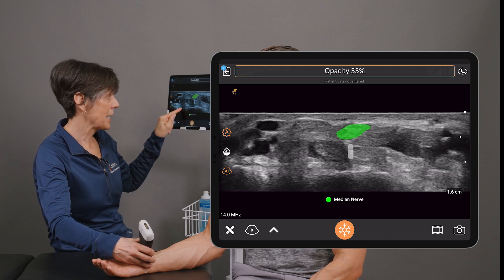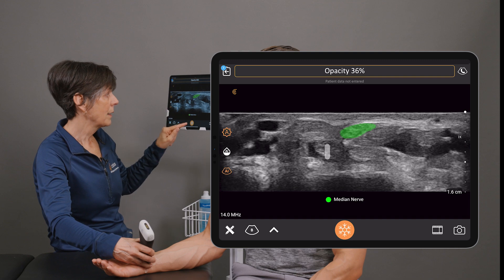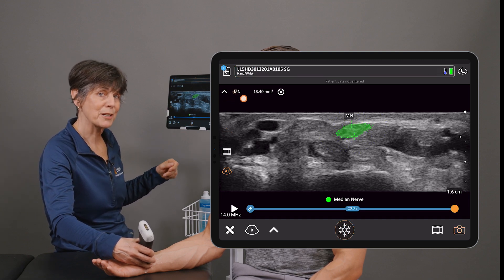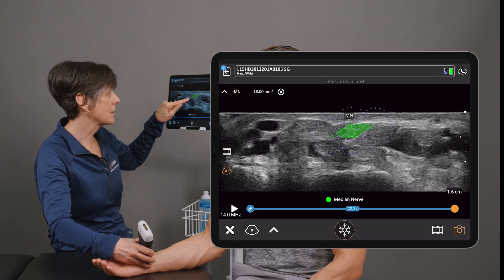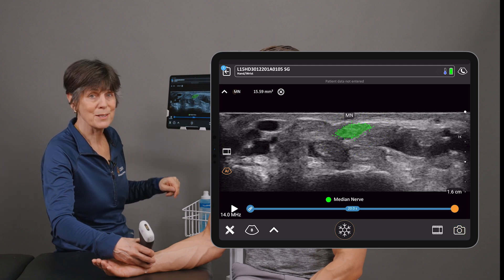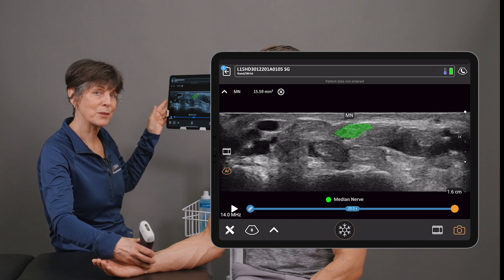I can adjust the segmentation of that nerve to my liking, and then when I hit freeze the app is going to perform that cross-sectional area measurement. I can adjust the calipers if I need to, but as you can see the measurement is pretty spot-on, and we're getting a cross-sectional area measurement of that nerve in the upper left-hand corner.